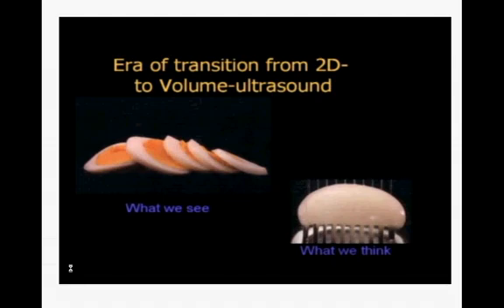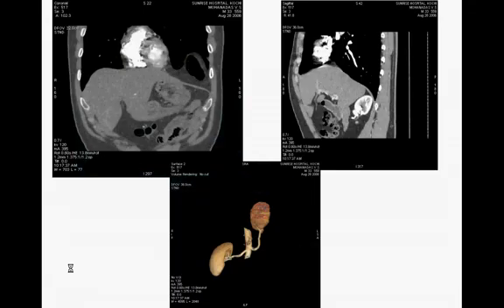Another important tool in the evaluation in TIFFA is the use of 3-dimensional and 4-dimensional images, 3D and 4D scans. What we were seeing in the 2-dimensional imaging were sliced images. We were seeing the sectional images, the planar images. But the human body being a 3-dimensional structure, we need to evaluate the body in all the 3 dimensions. And it is now possible with the 4D scan. Many people ask the question, why do we require a 4D scan in the evaluation in ultrasound?